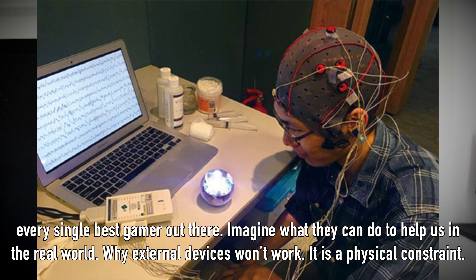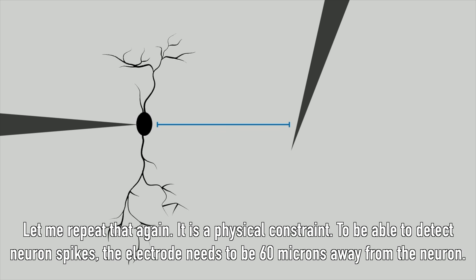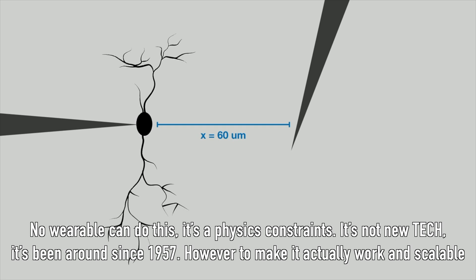Why won't external devices attached to your head work? Because it's a physical constraint. To be able to detect neuron spikes, the electrode needs to be 60 microns away from the neuron. No wearables can do this — it is a physical constraint.